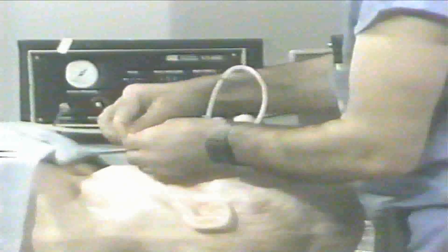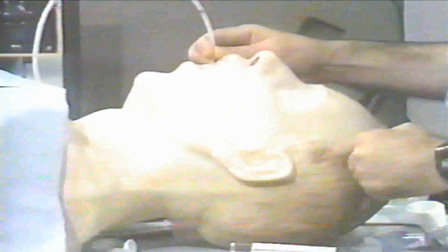High frequency jet ventilation in massive bronchial bleeding. One of the severe complications of Swan-Ganz catheter is bronchial bleeding. If that occurs, that can be fatal. One treatment which has been done is to establish high frequency jet ventilation, doing the laryngoscopy, putting a jet stylet tubing connected to high frequency jet ventilation, and while ventilation is continued, suctioning through the trachea and the mouth can be established. This has been shown to provide adequate oxygenation and anesthesia.